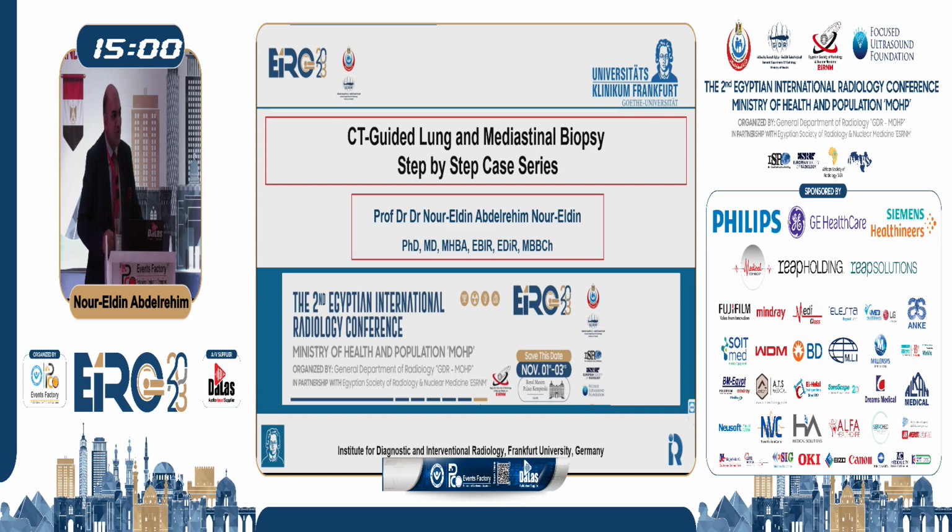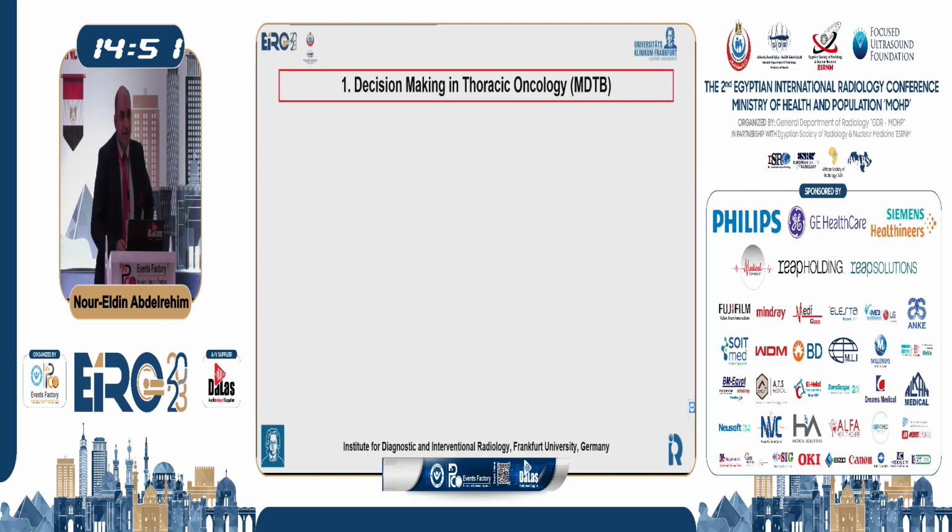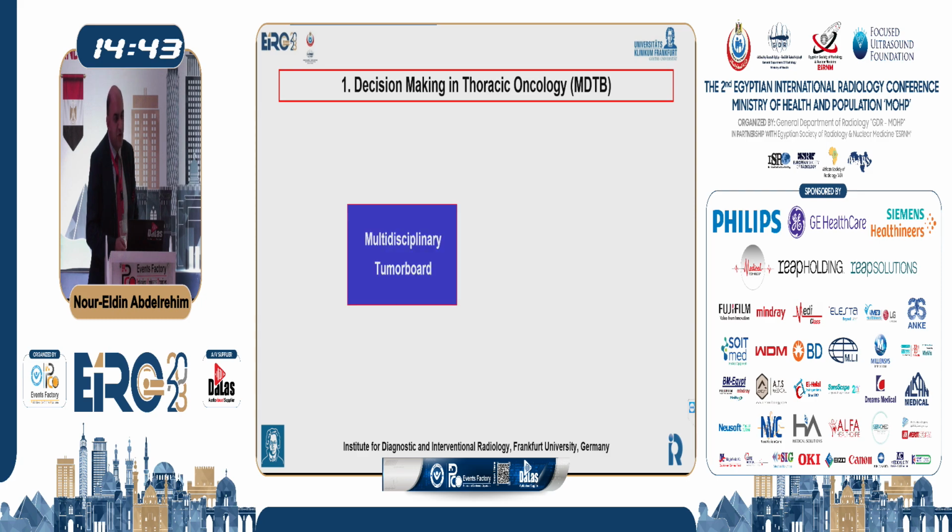Thank you, Mr. Chairman, for your kind introduction, and it's my pleasure to share with you our case series and studies in order to provide an overview of CT-guided lung and mediastinal biopsy. It's important to know that decision-making for thoracic oncology depends on the concept of the multidisciplinary tumor board.